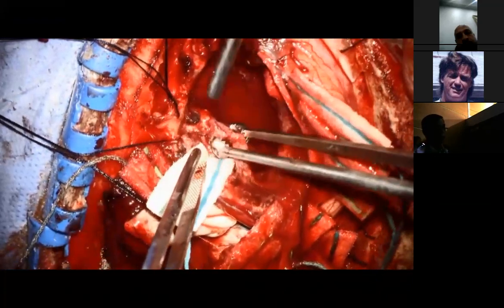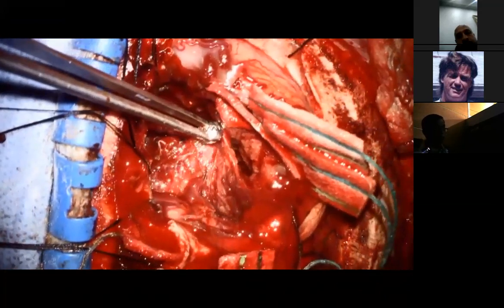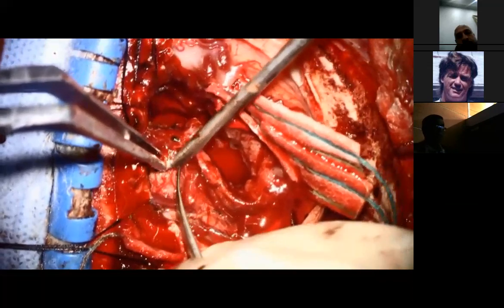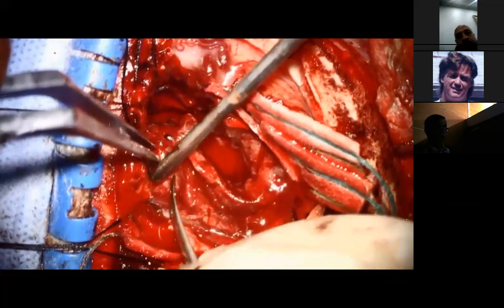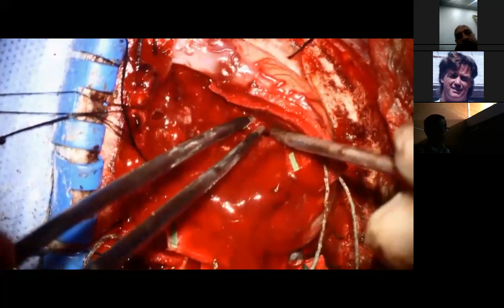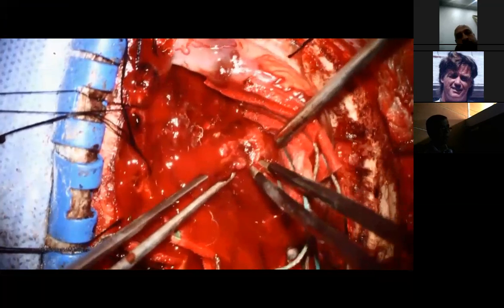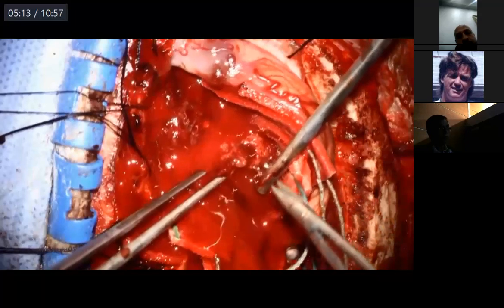You would come across enlarged veins like this. Some of it is draining the tumor, some of it is draining the normal brain. Again, these are very vital. If you damage them, you will cause venous infarct. And venous infarct will not show immediately. The patient will come out normal, and then she will have hemiplegia 8 hours later. So these are the veins that you want to protect. Again, here is cutting the blood supply to the tumor, preserving the normal vessels.